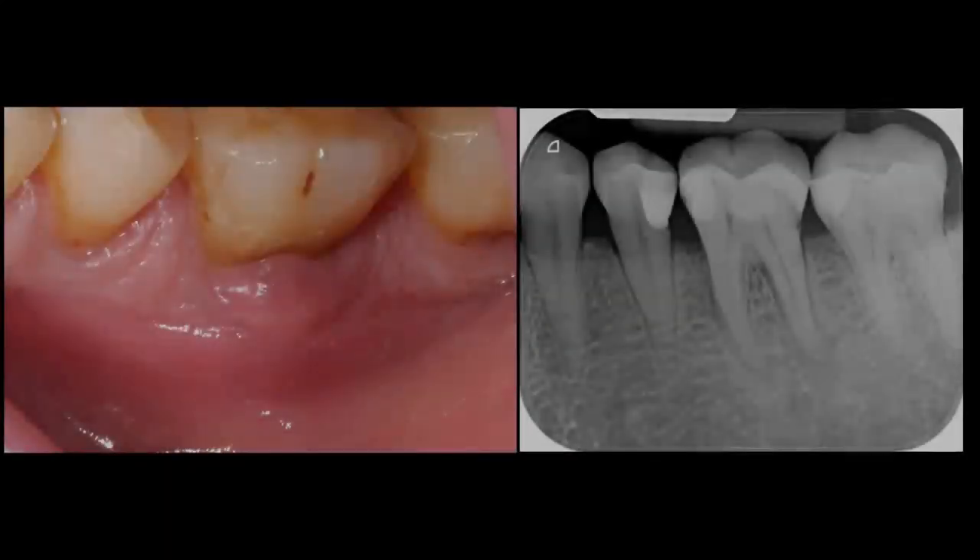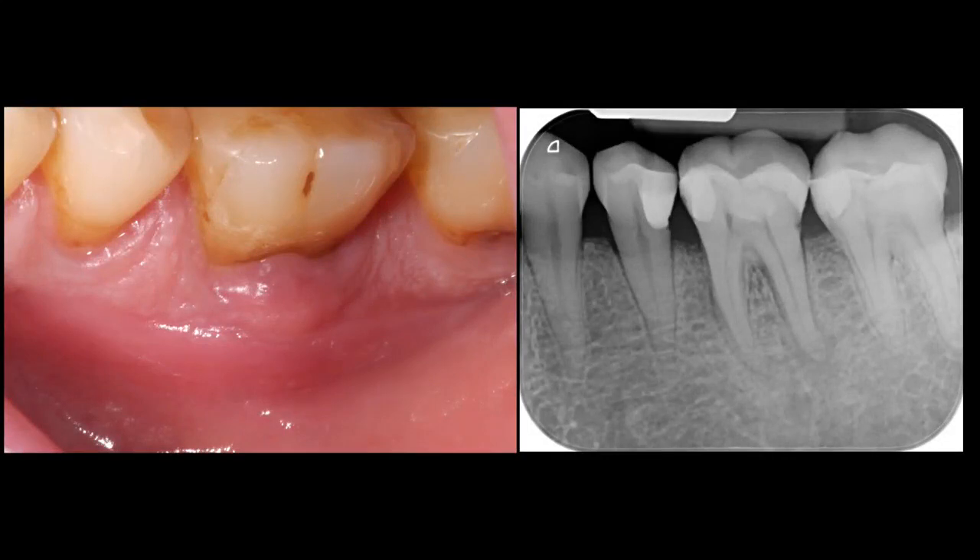This is the mandibular first molar of a 60-year-old woman with a large composite restoration and necrotic pulp. Swelling is present on the buccal gingiva.